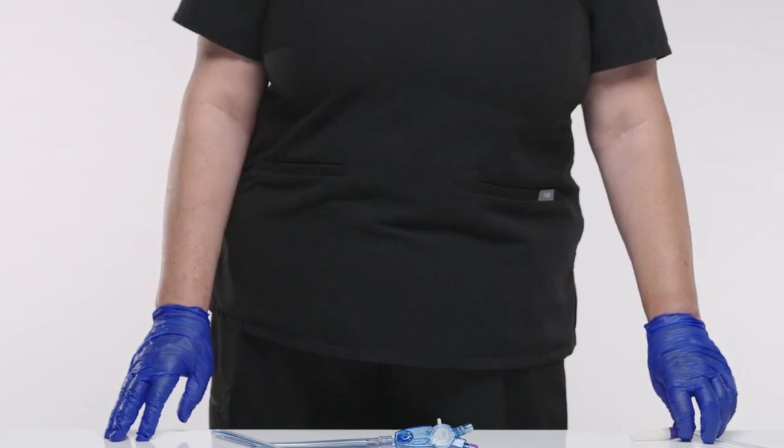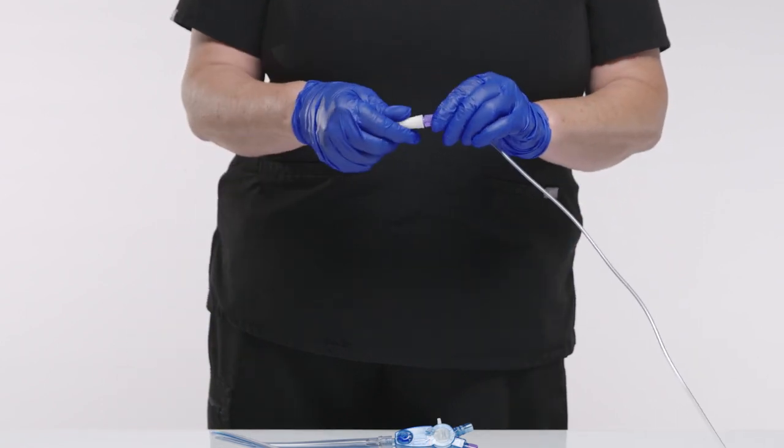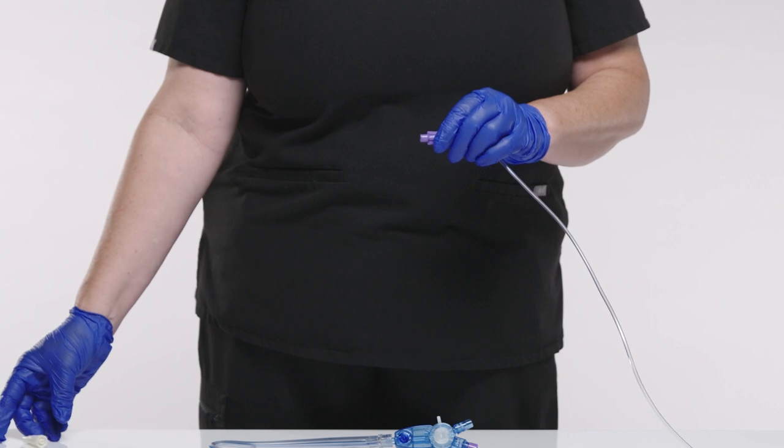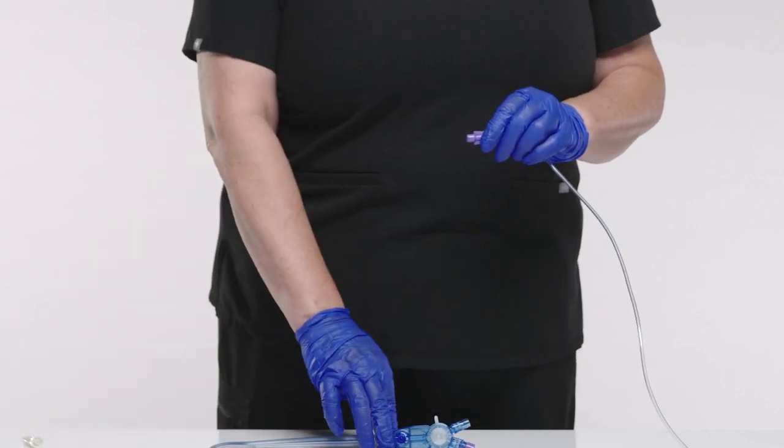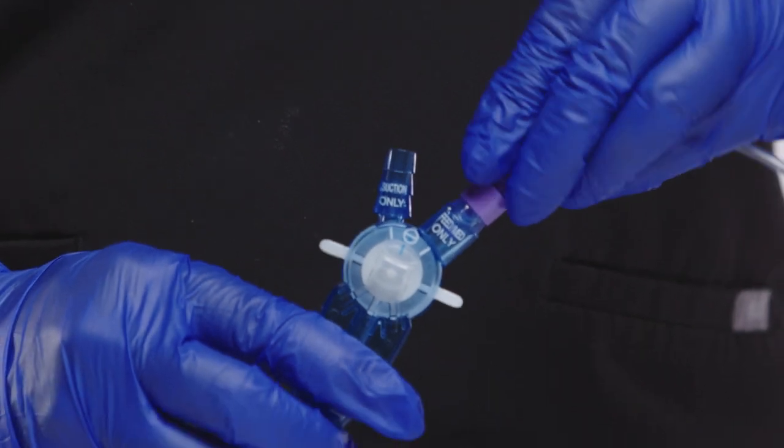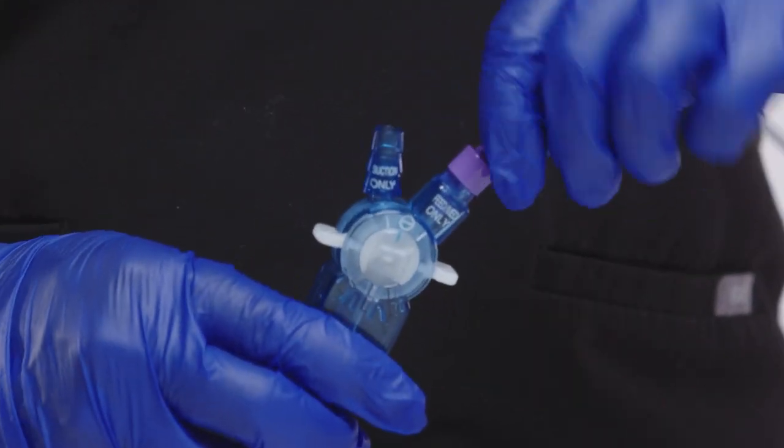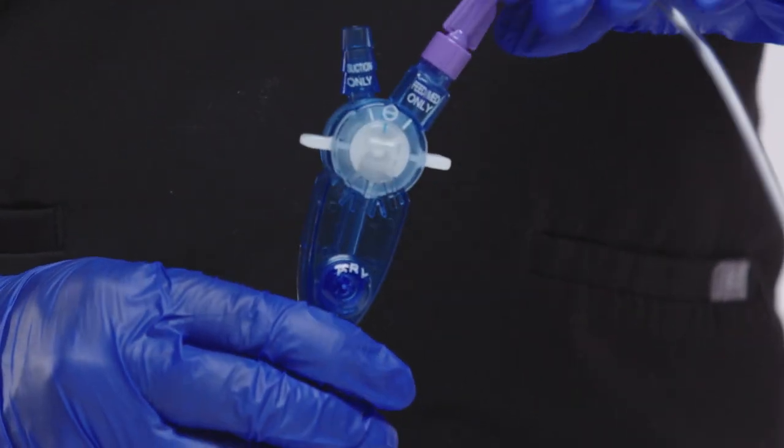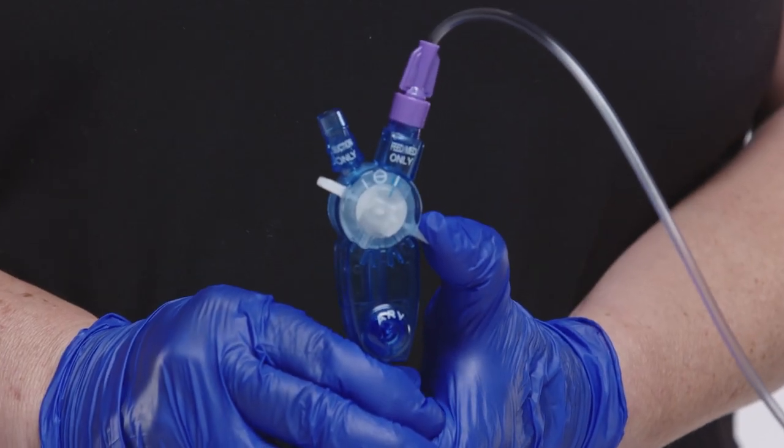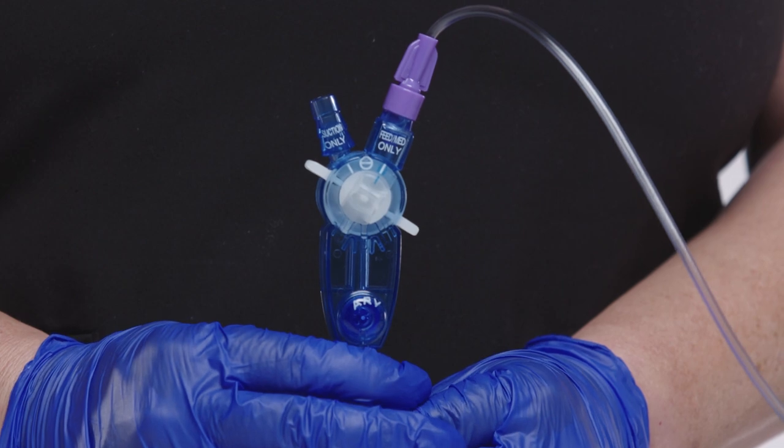If the white transition connector is attached to your feeding set, gently twist to remove the transition connector and discard prior to feeding with an EnFit Connection. Attach the end of the enteral feeding bag to the feeding port. Make a quarter turn and do not over tighten the connection. Turn the selection knob until the indicator line on the knob is aligned with the indicator of the feed port and begin feeding.